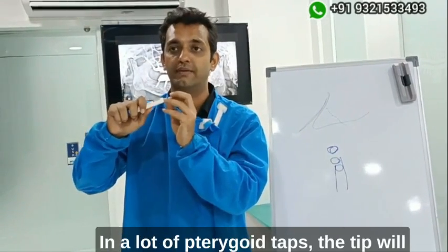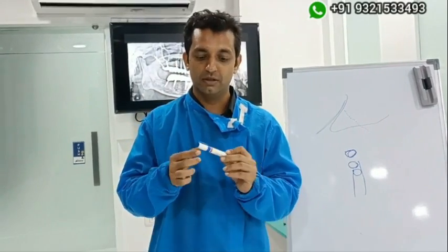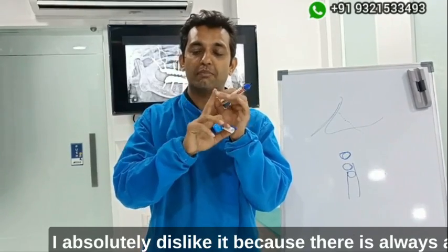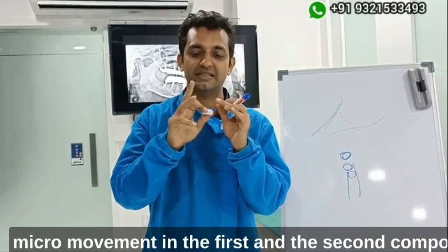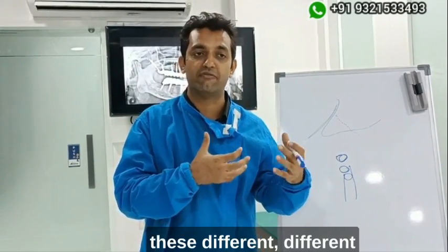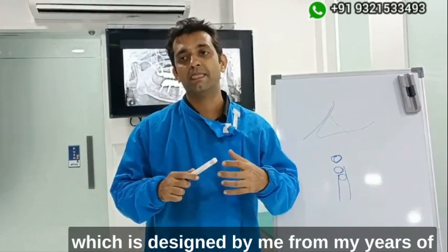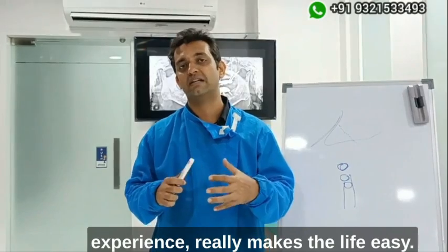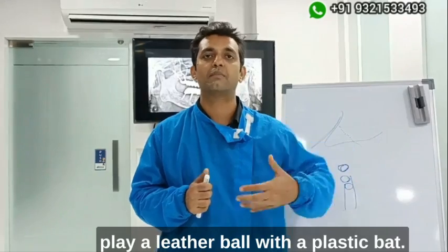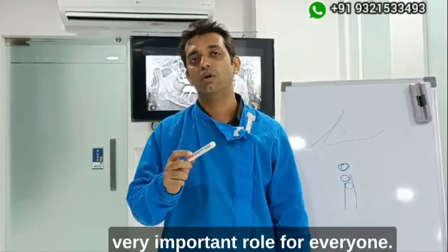The flat blunt end allows you to tap on it and hear the sound of the bone as you go in. Many pterygoid taps available have tips that become blunt even after one tap. Some are available as two components, which I dislike because there is always micro-movement between the components. After observing all these deficiencies in different pterygoid taps, the C-finder — designed from my years of experience — really makes life easy. The armamentarium plays a very important role.